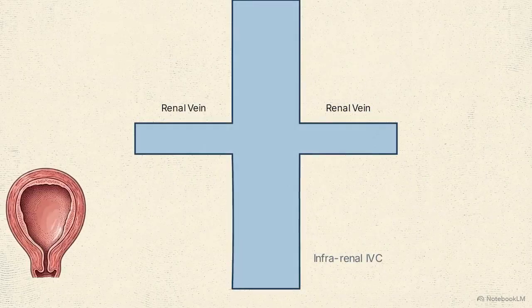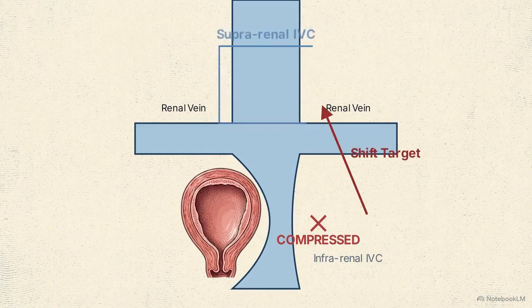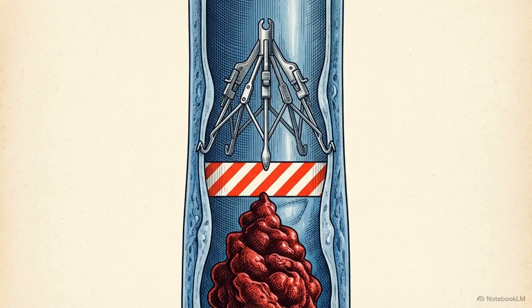The expanding uterus creates mechanical compression on the lower vena cava, forcing the operator to shift deployment to a suprarenal position. If the patient has an existing clot located proximally within the renal or gonadal veins, the standard target fails. Placement must shift to a suprarenal position to establish a secure perimeter above the risk zone.